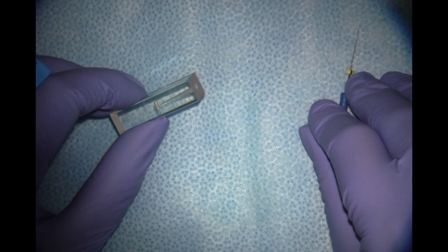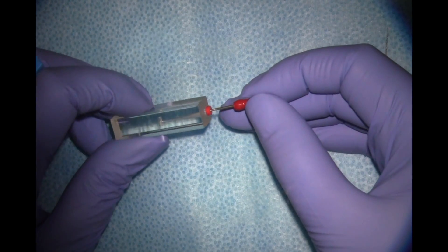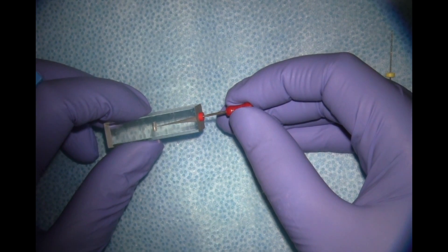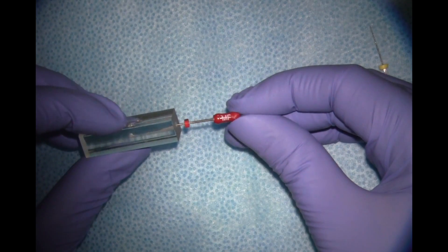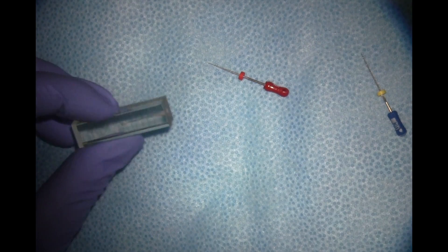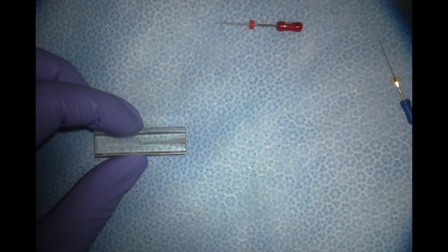I'm also going to verify that I've created adequate taper by placing a finger spreader in the canal and ensuring that it can go within one millimeter of my corrected working length. Since my corrected working length is 16, my spreader needs to go to at least 15 millimeters — and it goes there easily. For this average-sized canal I'm using the medium fine spreader, which says MF and has a red handle. There's also a fine spreader — blue handle, marked F — which you'd use in a larger canal.